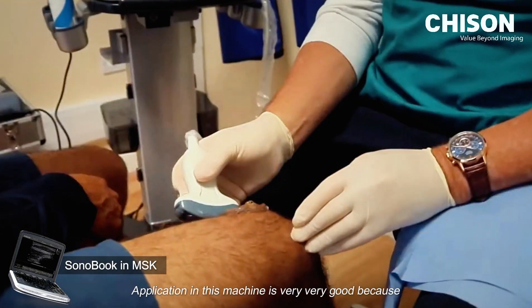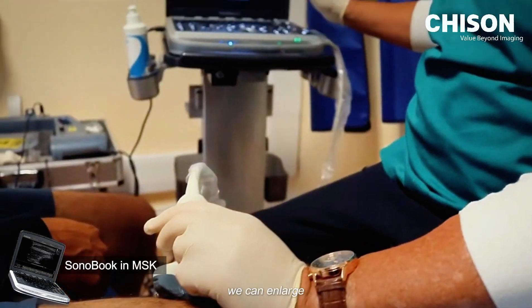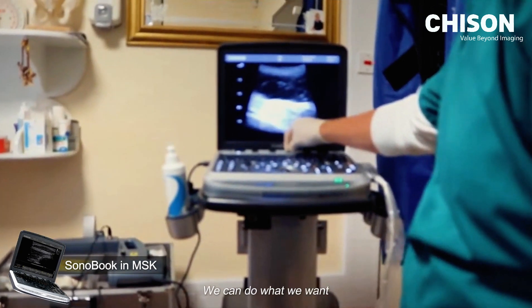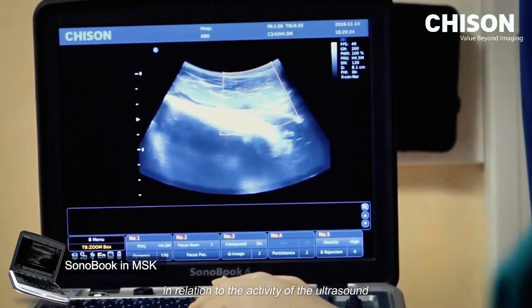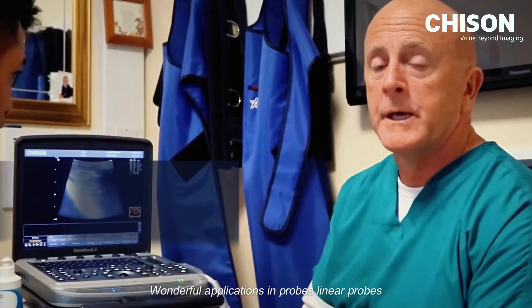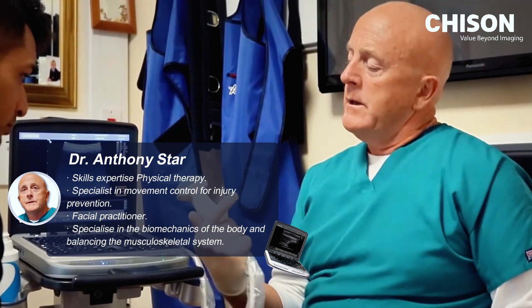The applications on this machine are very good because you can use the Doppler, you can enlarge, use the Doppler with the probe and move it around — we can do what we want in relation to the activity of the muscle. We're able to identify any problems with vascular activity. Wonderful applications and probes, including linear probes, for depth.